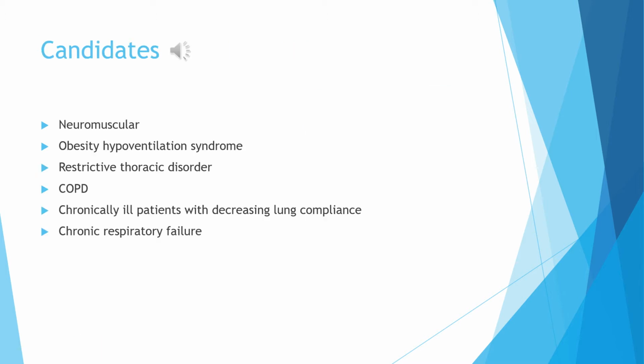Patients that should be considered for AVAPS are any patients who have chronic respiratory failure. This includes COPD patients, neuromuscular patients, and patients with obesity hypoventilation syndrome.